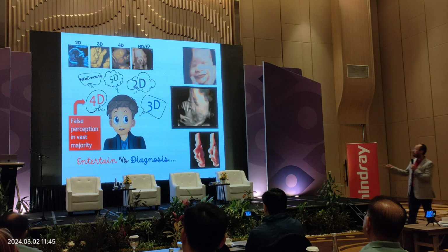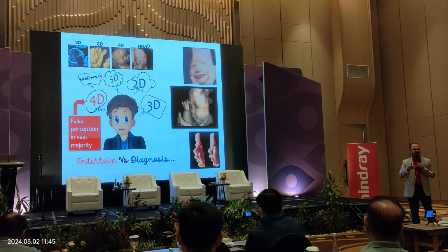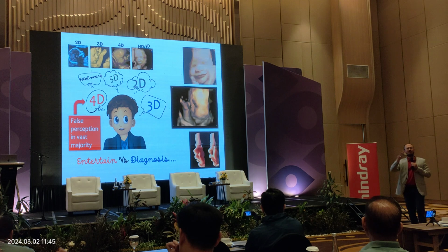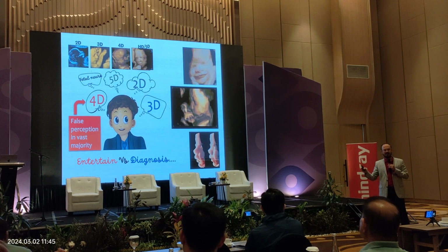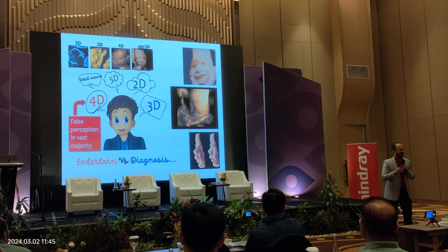The term 4D is about doing 3D with motion. Okay? 5D, there is no such term in the scientific or academic world. 5D is only a term of entertainment.